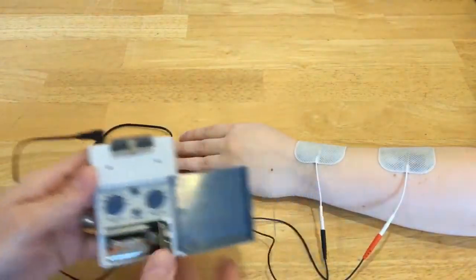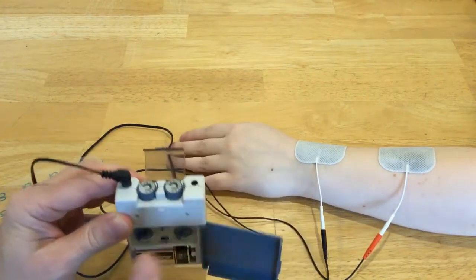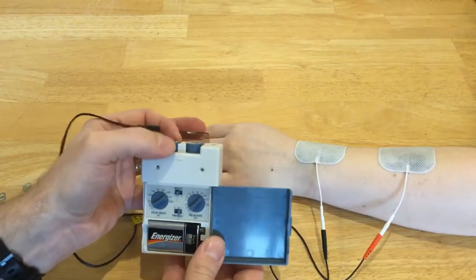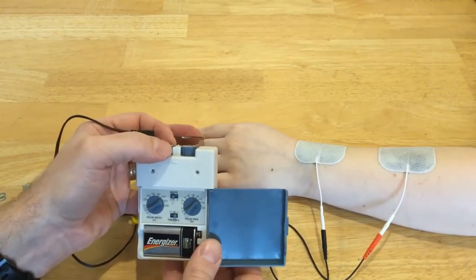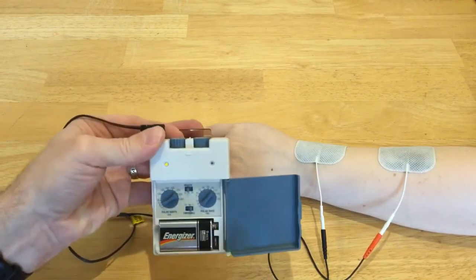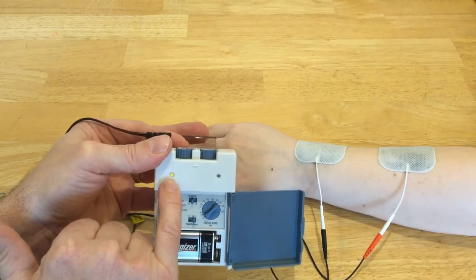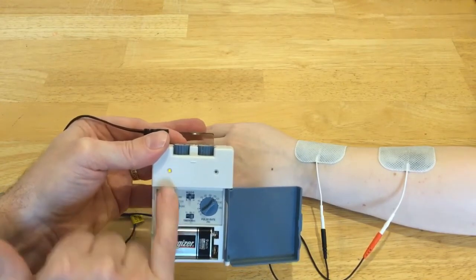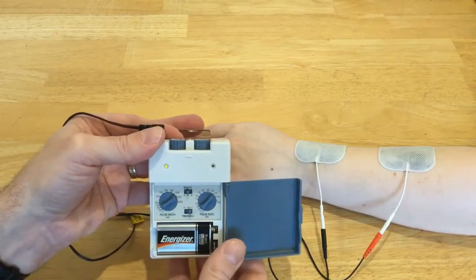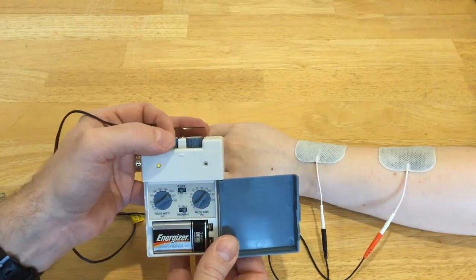Now I'm going to turn it on by turning the dial and then slowly turn it up. My client will simply tell me when she first feels anything at all. You'll notice that when I turn it on, the little LED indicator goes on, and that actually flashes according to the pulse frequency or the pulse rate. Since the pulse rate is 120, it looks like it's continuing on, but it's actually flashing 120 times a second.